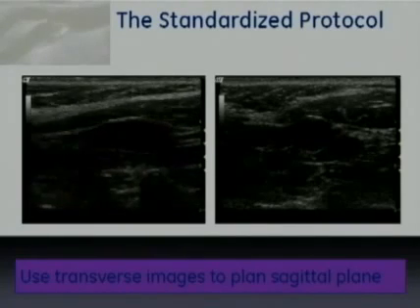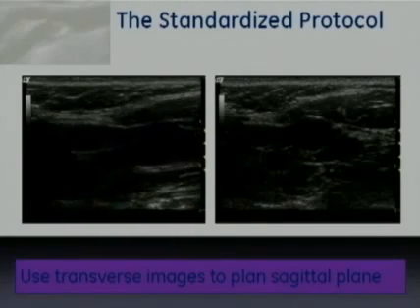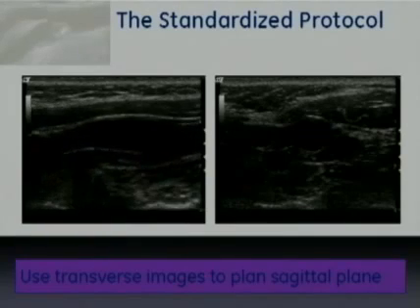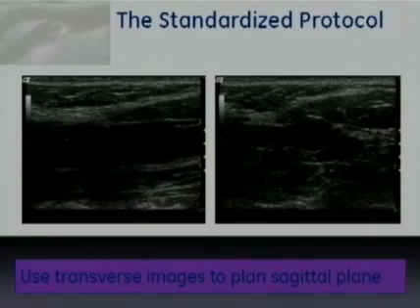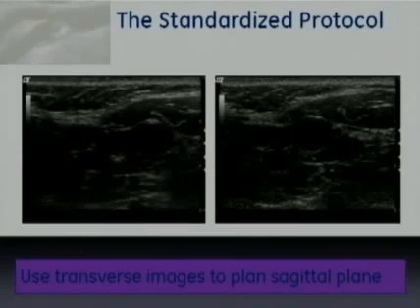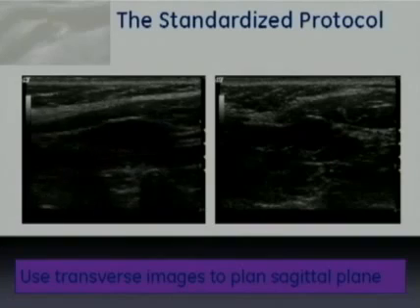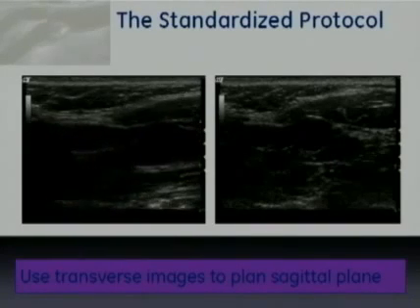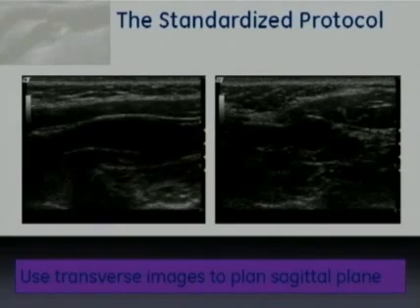This isn't a large motion, it's a very tiny motion because these vessels are actually quite close together, just going back and forth, and then making sure that each one of them ties back to the common carotid artery. Why is this important? Because it ensures that we're looking at two different vessels rather than one vessel from two different views. Which is a mistake we might make if we pick up the probe and simply move it between the vessels. It's easy to actually look at the same vessel and actually mislabel it as two different vessels. So this will keep you from making that mistake.